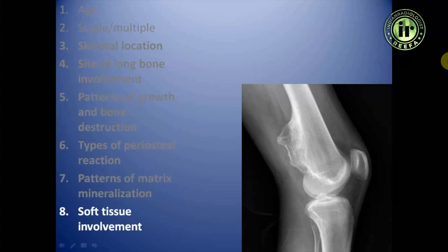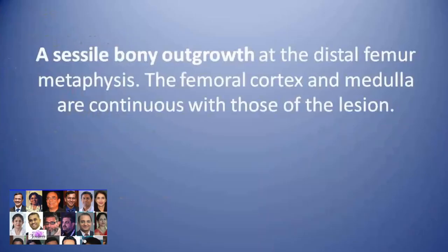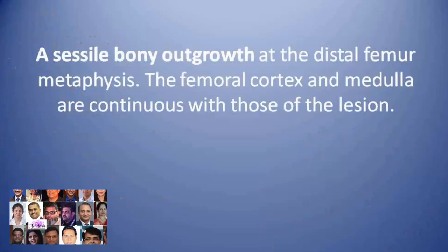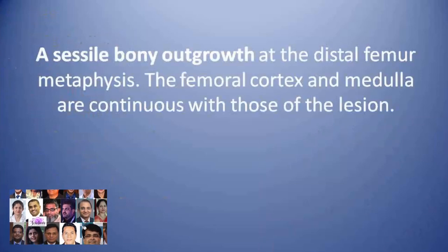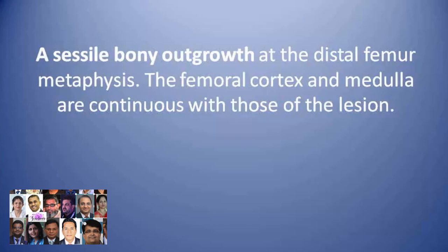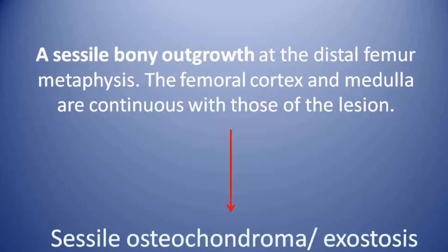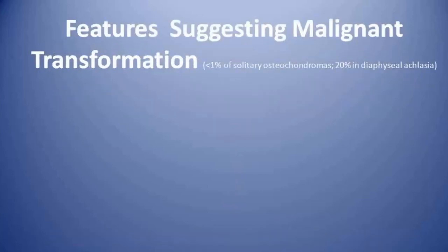There is no obvious matrix mineralization, and the lesion can impinge on the adjacent soft tissue. This is the case of a sessile bony outgrowth at the distal femur metaphysis. The femoral cortex and medulla are continuous with those of the lesion.